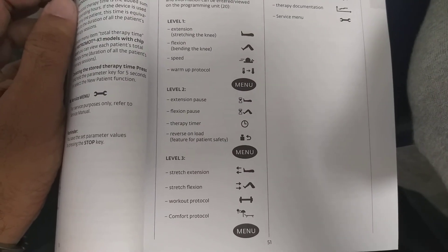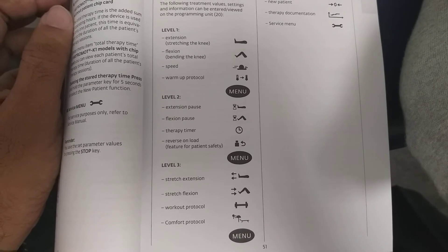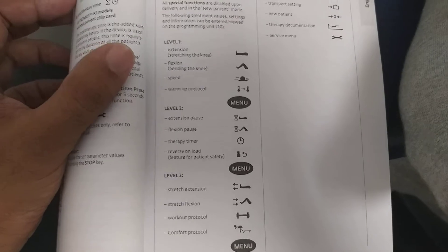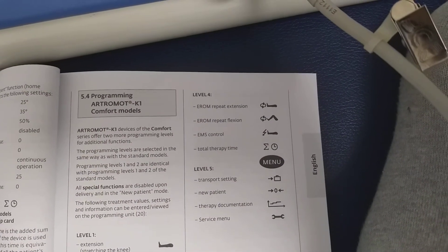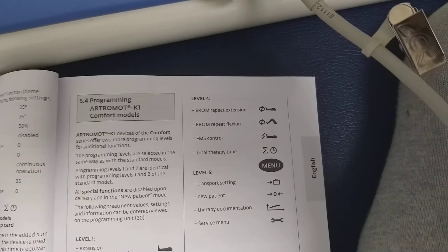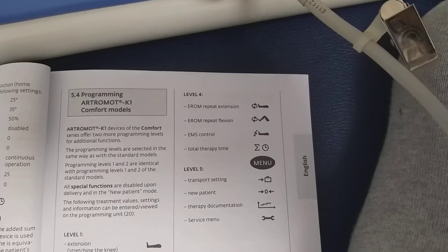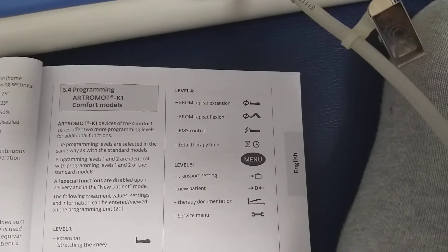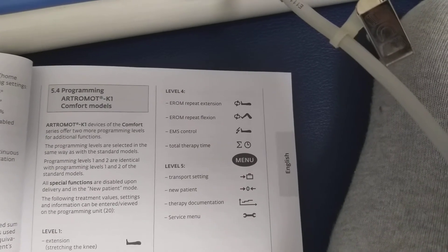In level 3 there is stress extension, stress flexion, workout protocol, and comfort protocol. Level 4 has E-ROM repeat extension, E-ROM repeat flexion, EMS control, and total therapy time. Level 5 has transport setting, new patient, therapy document, and service menu.